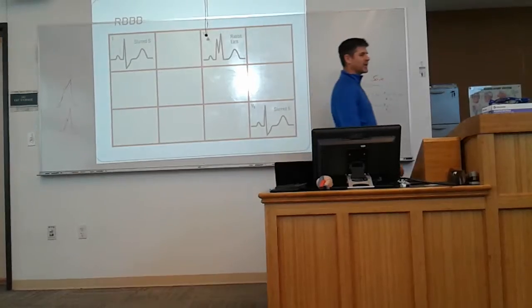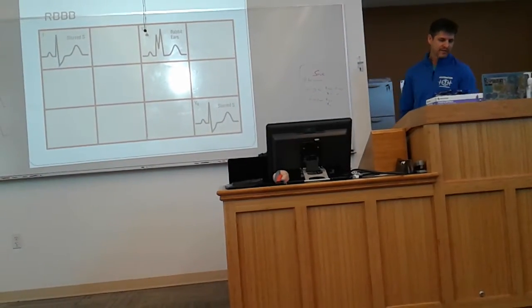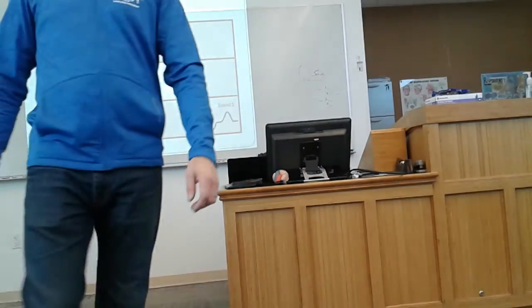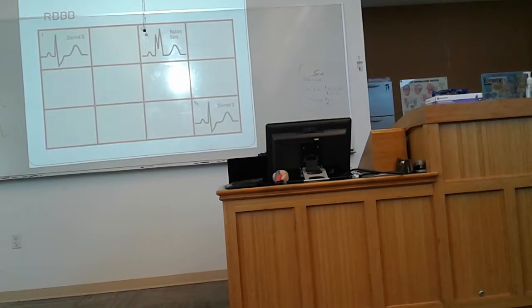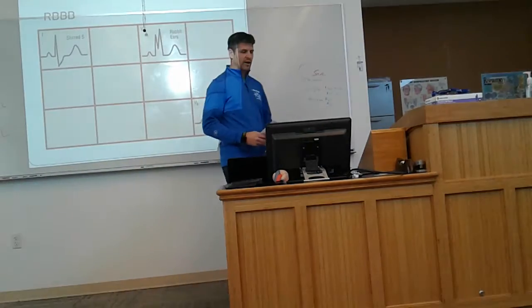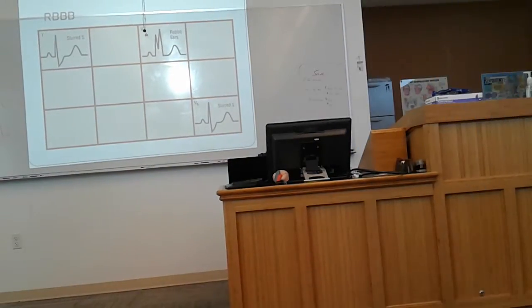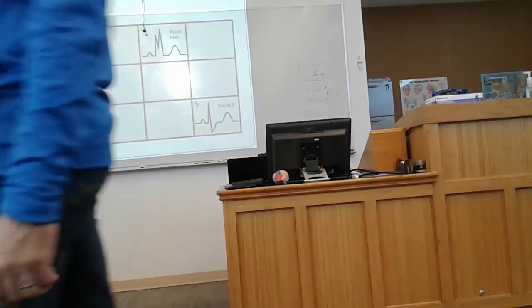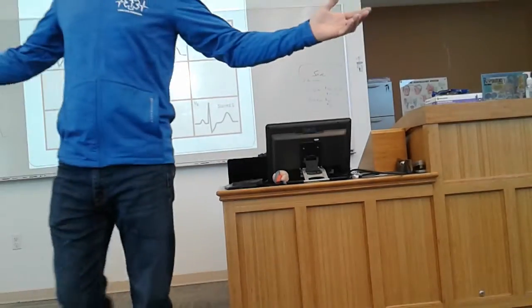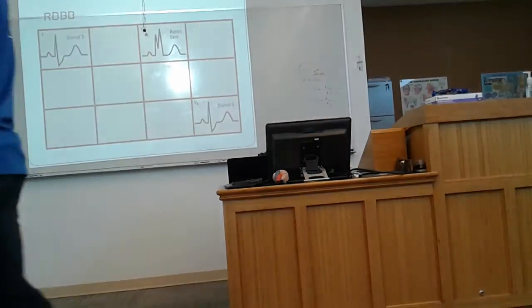After you find the page that says bundle branch blocks and has a bunch of writing on it, turn the page and look at the very first one, number 1 of the bundle branch blocks. Is that rhythm supraventricular? Yes. Does it have a wide QRS complex? Yes. Which QRS complex would you have to look at to be able to tell that? Any of them, because it's all the same. It doesn't matter which one you look at for wide width. You just have to find one that shows you a clear width.